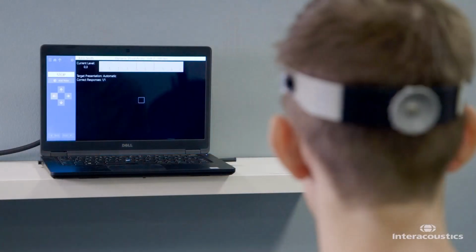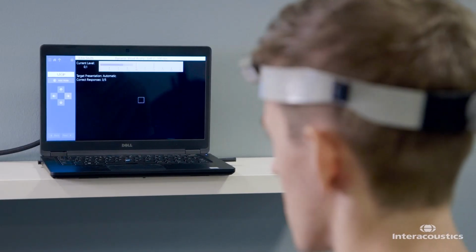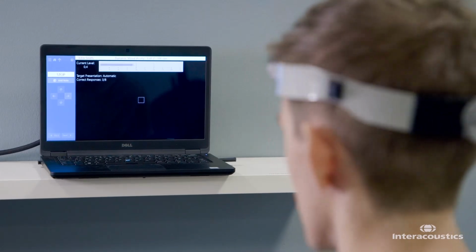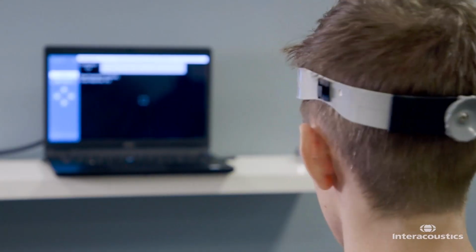So if you look at tests such as dynamic visual acuity, the DVA test, or gaze stabilization, the GST test, these are tests of the functional VOR by assessing how well somebody can see by moving their head quickly. But one of the things that really does start to become a little bit more interesting is we see this development in the healthcare field where function and physiology don't always marry up. So we want to have more information around what the functional status is of a patient.